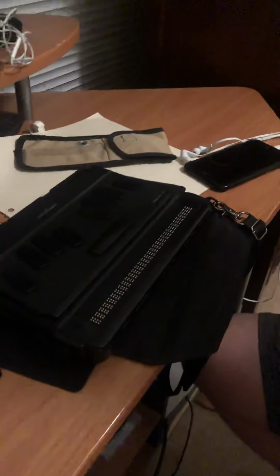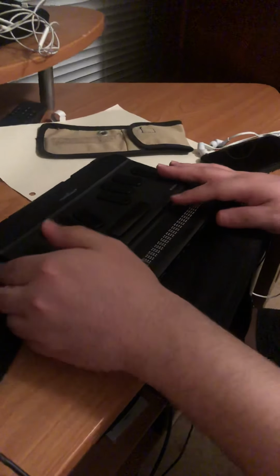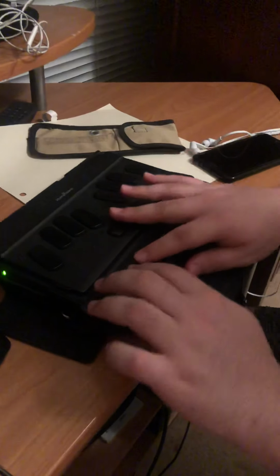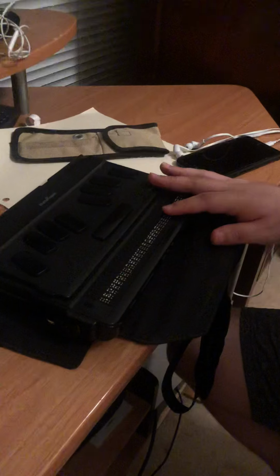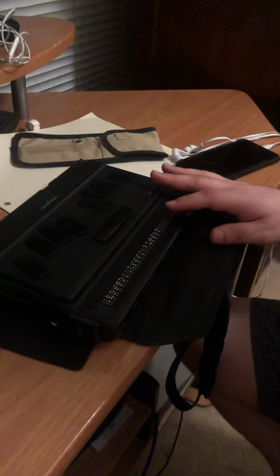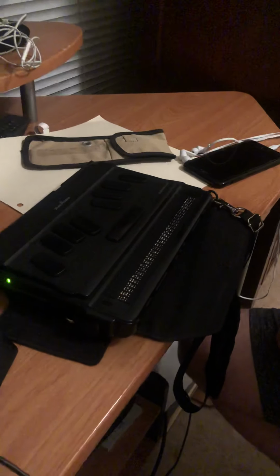So you may wonder how does it work? So I'm gonna show you guys how it works. As I alluded to in my iPhone video, Braille is a code, or it's not a language, but I think of it as a code that blind people use.